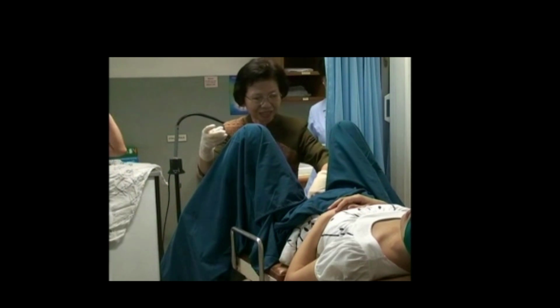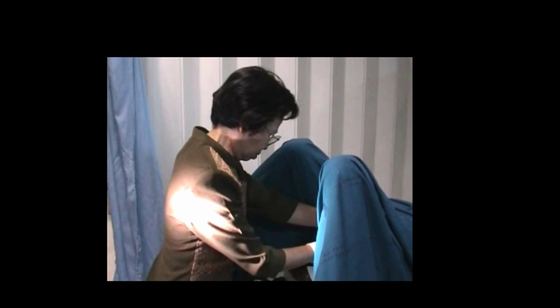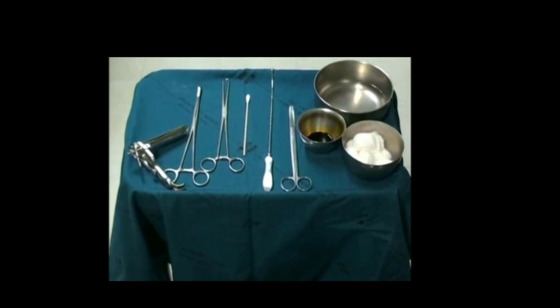Perform a pelvic examination to rule out genital infections or abnormalities, as well as to ascertain the position of the uterus. You will need to follow appropriate infection prevention procedures, including the use of sterile instruments and cleaning of the cervix with a water-based antiseptic such as chlorhexidine.